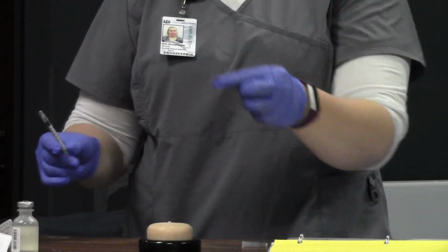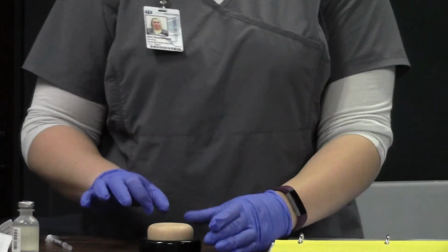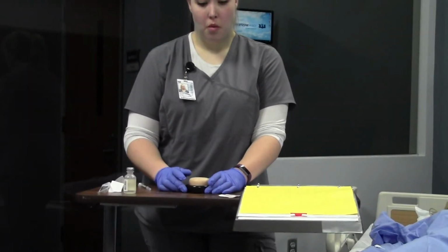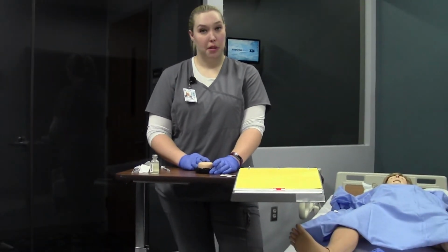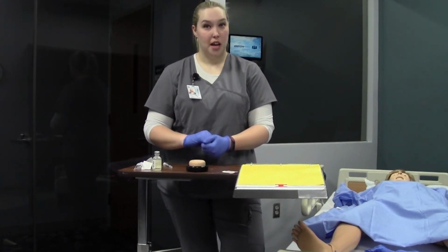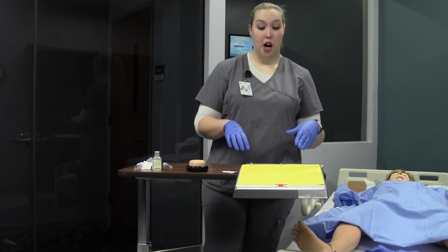And you're going to activate your safety. In this case, the syringe doesn't have a safety, so I'm going to go ahead and recap. What you are looking for on your patient is a wheal or a bubble. Our low fat pads don't hold the bubbles anymore. And then what you're going to do is just blot gently with a piece of gauze any blood, and then you're not going to put any band-aids or anything over the top, as that could compromise the testing solution itself.